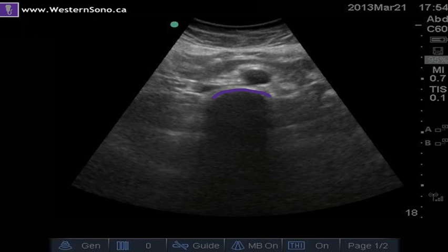This reminds you to be sure that you are looking for the outer echogenic walls of the aorta to be sure its maximal diameter is less than 3 centimeters. In this case, we see that it is. The diameter can be measured by calipers on screen or be estimated by the hash marks on the right-hand side of the screen. Incidentally, here is the IVC, and it appears relatively collapsed in this still image.